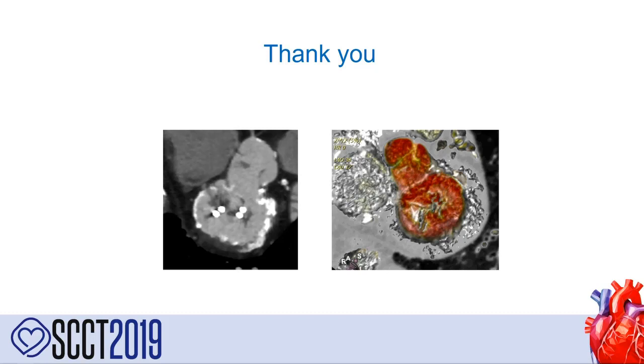One option would be to use the Lampoon device. So if you went ahead and did your CT and saw a small neo-LVOT, then you would know that by doing the Lampoon, you had the potential to increase that size. You'd do a CT afterwards, and then literally planimeter the areas that would be open to see if the neo-LVOT makes it. I hope I answered your question.